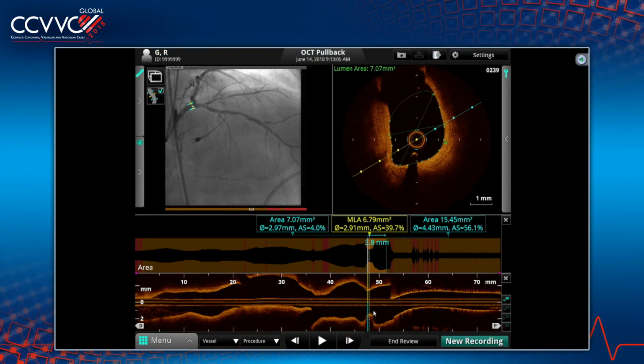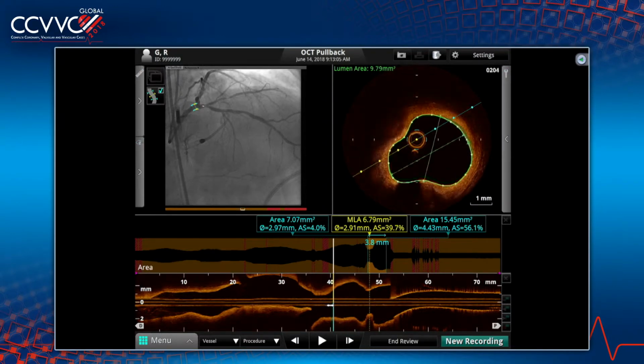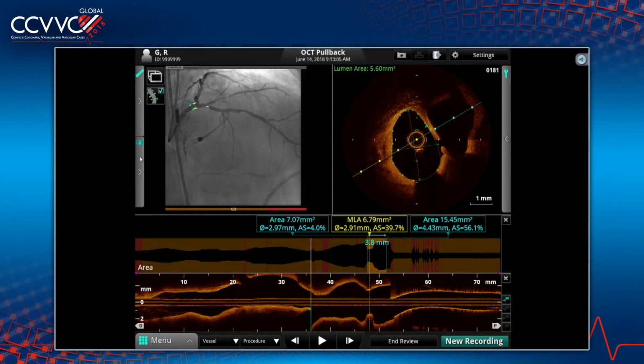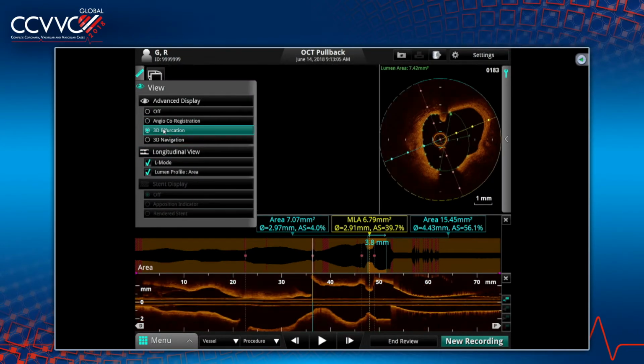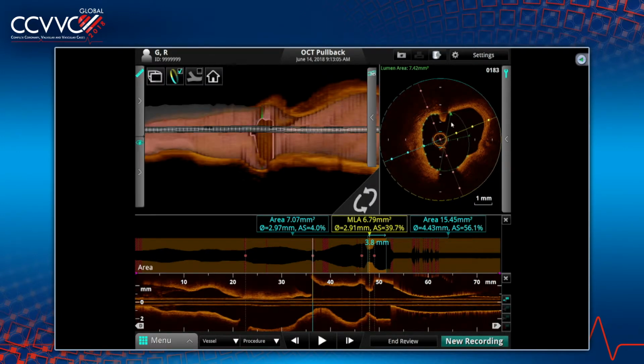Now, the only question will come, the patient has Impella, we are going to FFR, but the question is, now with the Impella, what does FFR mean? Go to the LAD diag and show us the 3D reconstruction there. No, go to LAD diag. What is the cross-sectional area of the LAD at the level of the diag? There's the diag right there, right?